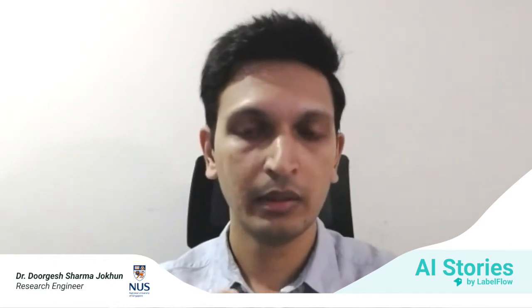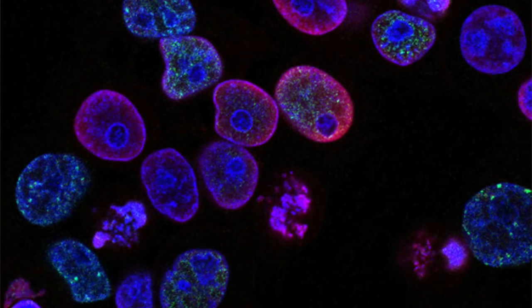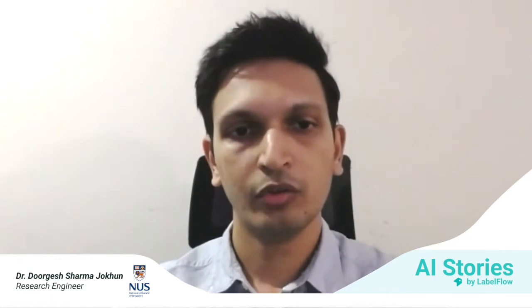But usually to do that, you need to process the sample a lot. You need to stain it with different types of dyes and all that. And what happens then is, when you've identified the tumor, you've lost the sample because the sample was degraded. So you can't do downstream analysis with that. So one of our aims was to be able to do this without degrading the sample, so that in case we identify a disease, can we do further tests on the same sample to help with the treatment? So that's another thing that we've tried to address.